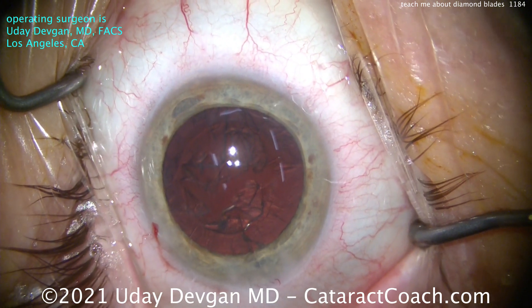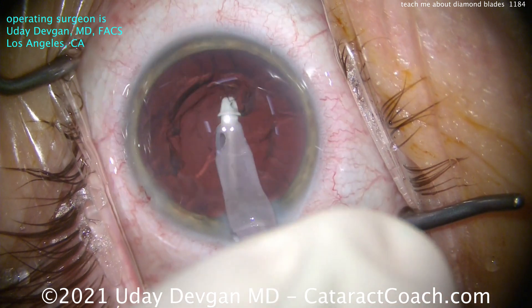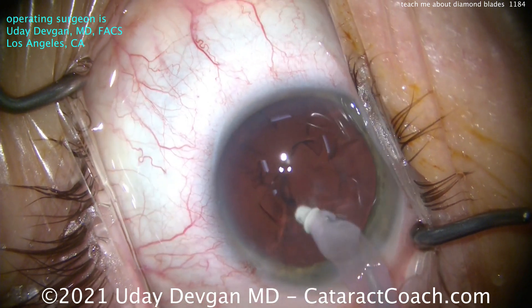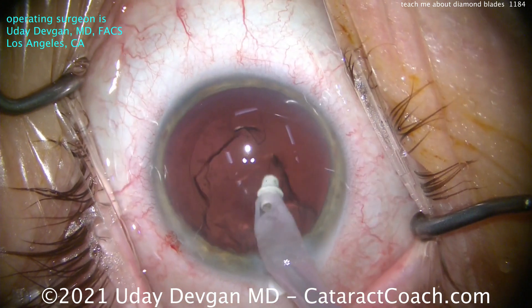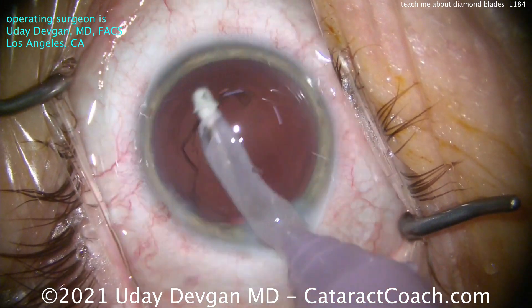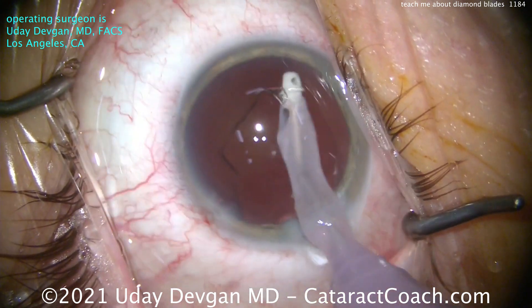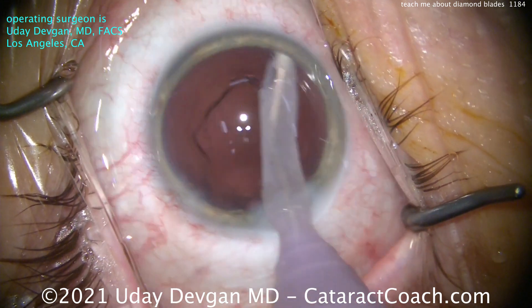Remember, the eye is like an under-inflated balloon. What's the normal eye pressure? 15, 16, 18 millimeters of mercury — that's pretty soft. To make an incision in an under-inflated balloon, you need a very, very sharp instrument, and the diamond keratomes are absolutely the sharpest. So for my patients when I do surgery in Beverly Hills, I use a diamond keratome.